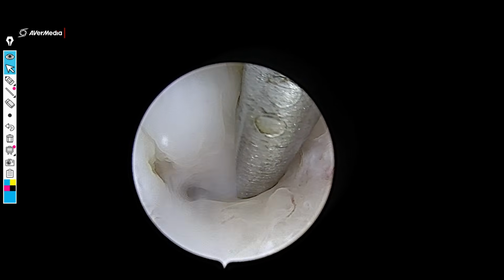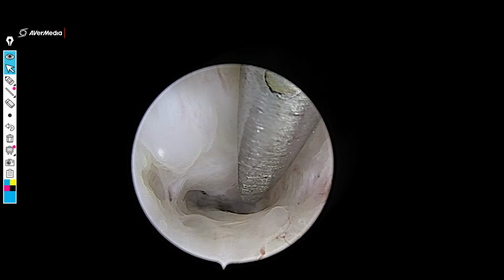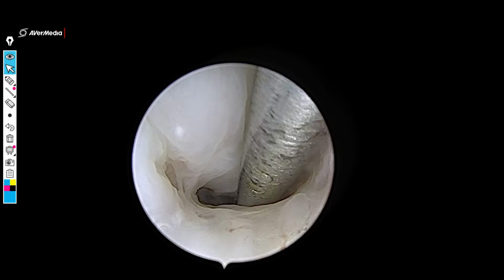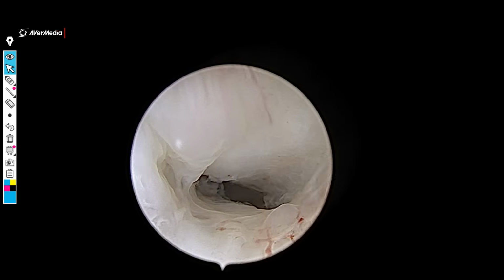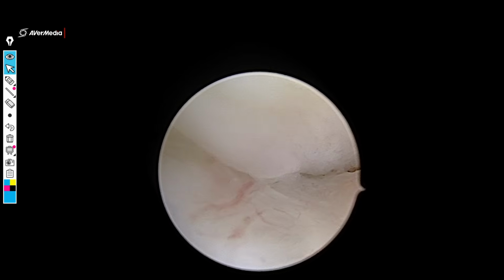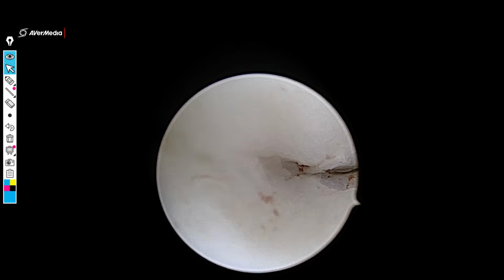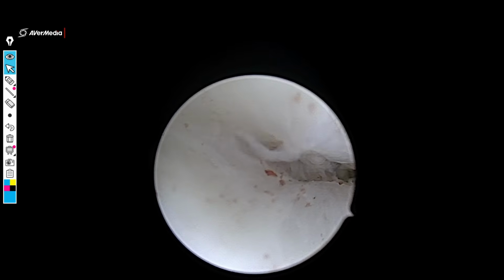And rather than using a dilator, the worst thing I think one can do is to try to use a dilator in this case. Rather than using a dilator, here we are going in with a 2.9 millimeter hysteroscope. It's much better than a 4 millimeter hysteroscope, because this fine office hysteroscope is able to walk inside the cavity with minimum dilatation.